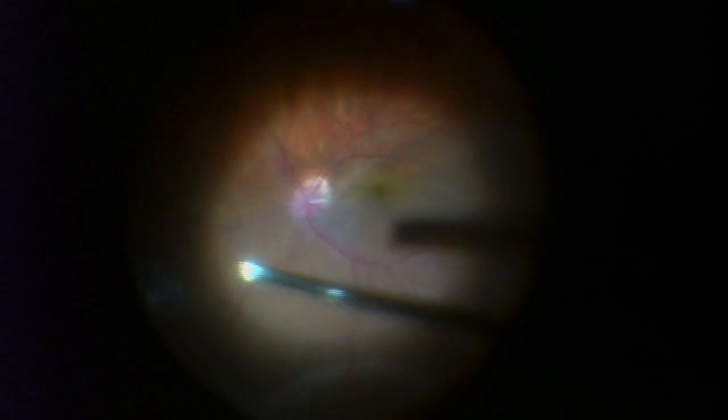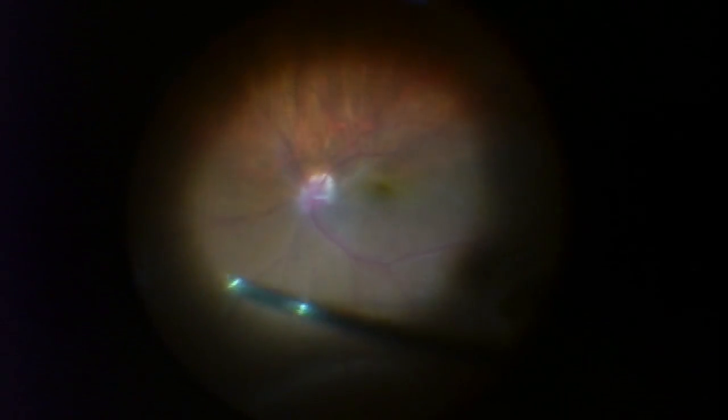The undulating tissue is actually the retina, and there is fluid underneath there — technically it's detached. Detached retina does not see very well, if at all, and patients usually notice loss of peripheral vision moving centrally.